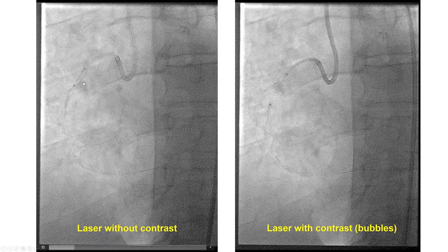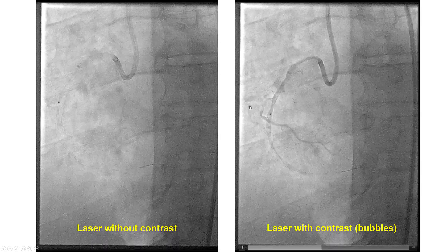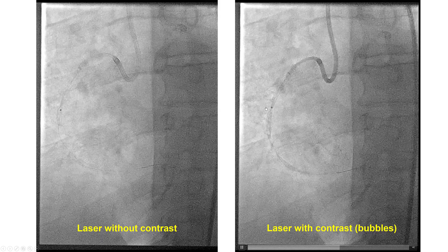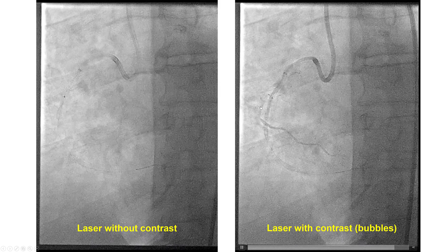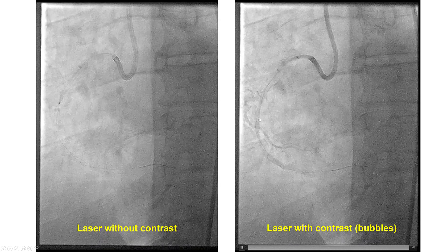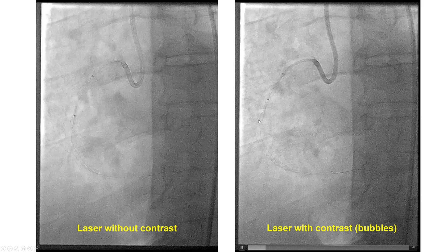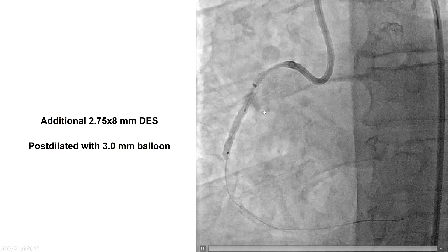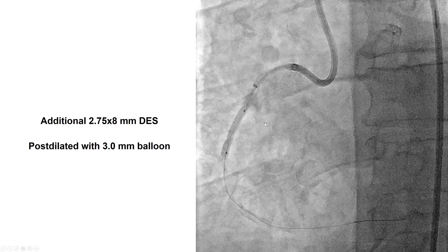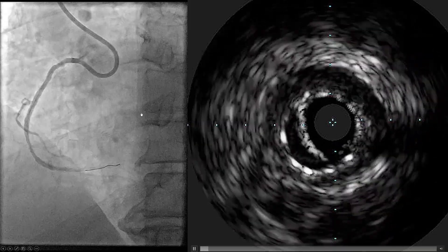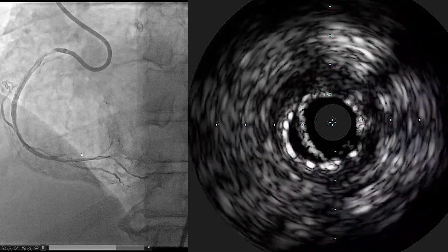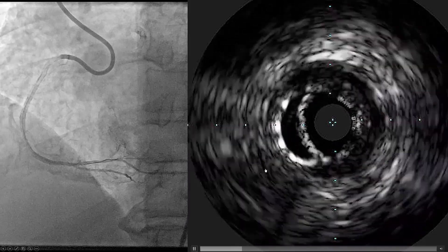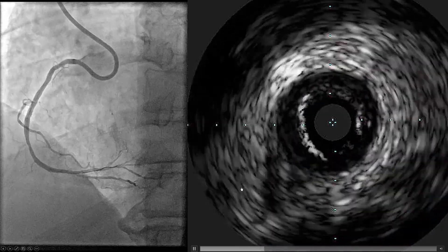In this particular case, we used laser with simultaneous contrast injection. Rarely, there can be a cavitation effect and formation of bubbles, as was the case here. This resulted in good expansion after post-dilation with a balloon and a nice final result, both angiographically and also with intravascular ultrasound.